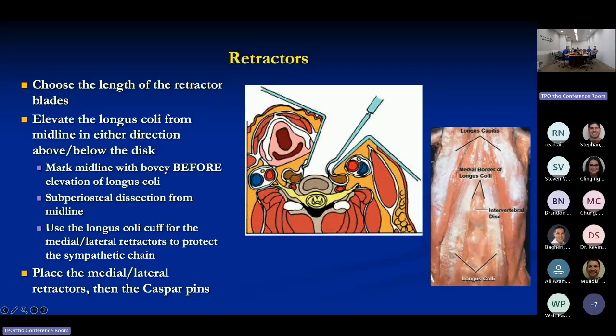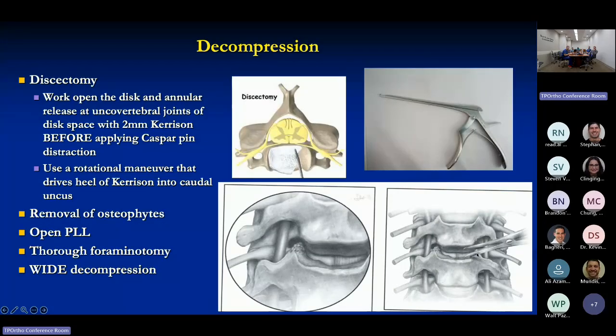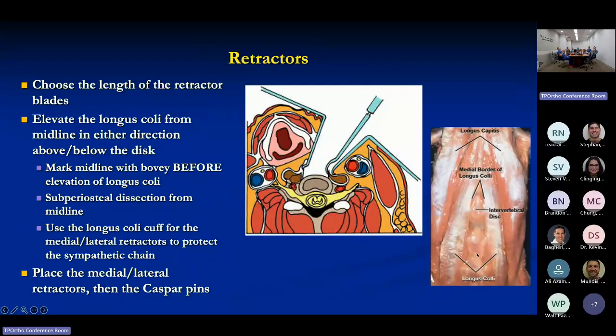So let's say, sorry guys, it's not working on here. Let's say you're going to do C4-5 here. I would bovie mark the vertebral body right here, and then the vertebral body right here. That way you know where your midline is from there on out. And then subperiosteally dissect cephalad and caudad to those two marks and up to the lateral aspects of that disc space and elevate the longus colli off.